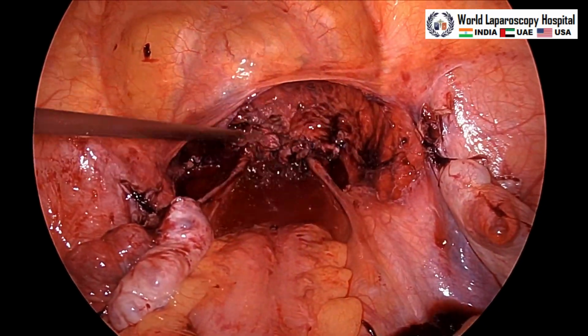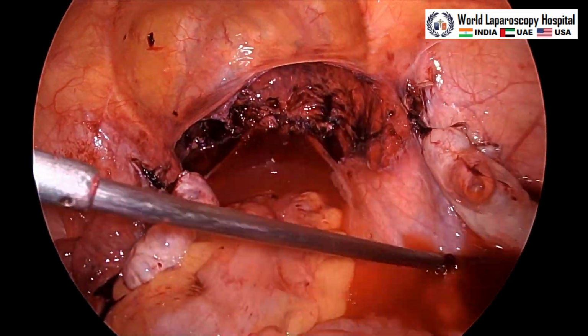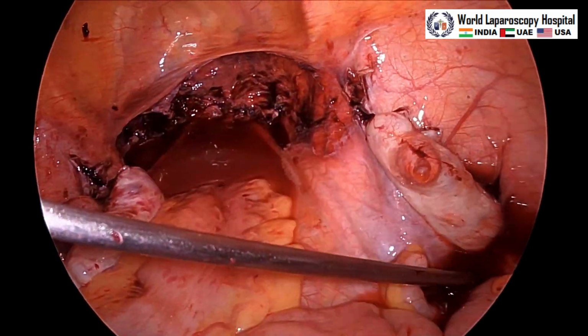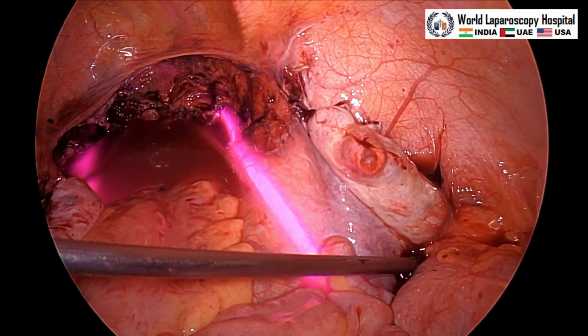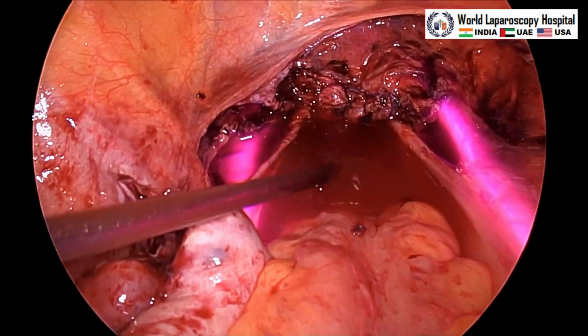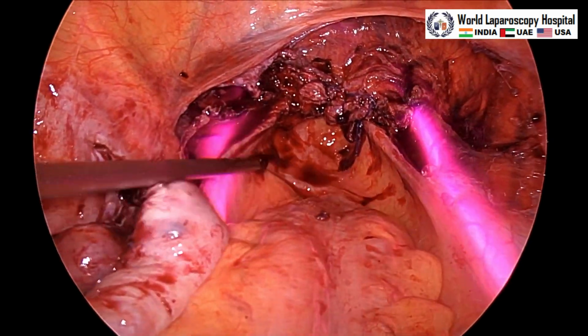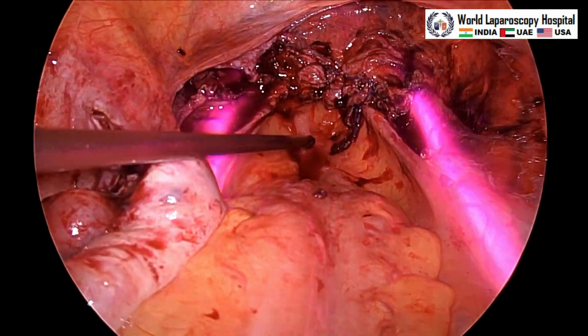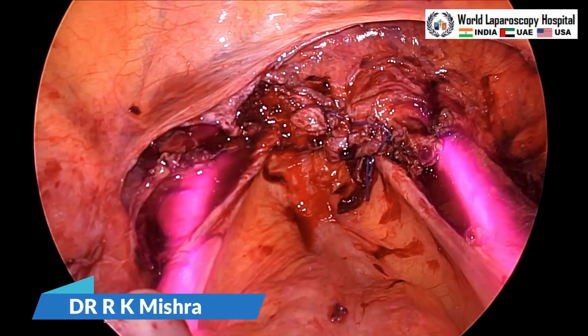This is just a final suction irrigation which you can carry out, and you can inspect all around, and after that the ureteric catheter will be taken out. So the tip of the ureteric catheter is already outside the urethra in this situation, so just directly you have to pull it. It doesn't require cystoscopy again. So this is over. There is no bleeding, everything is dry.